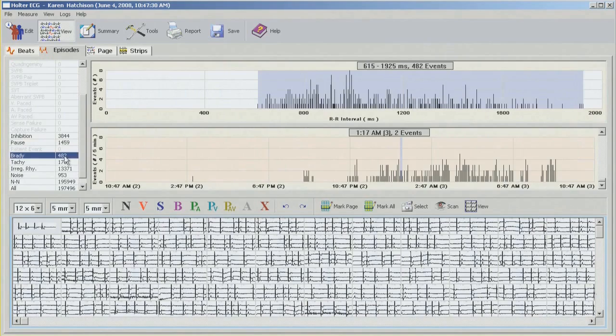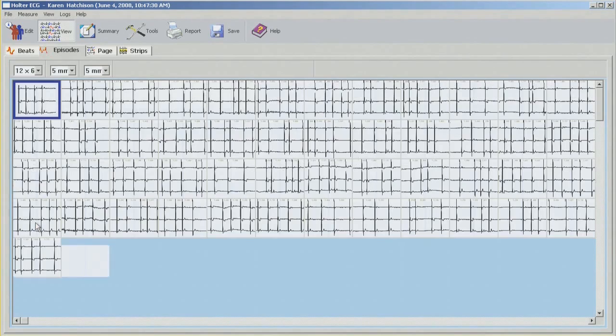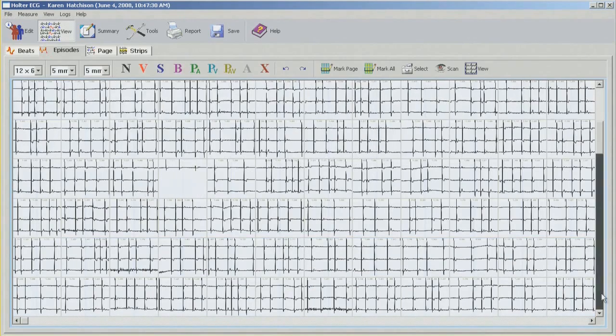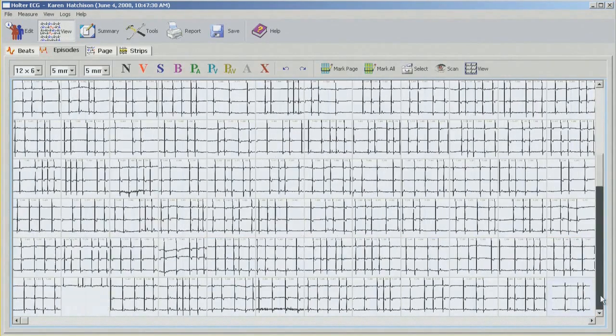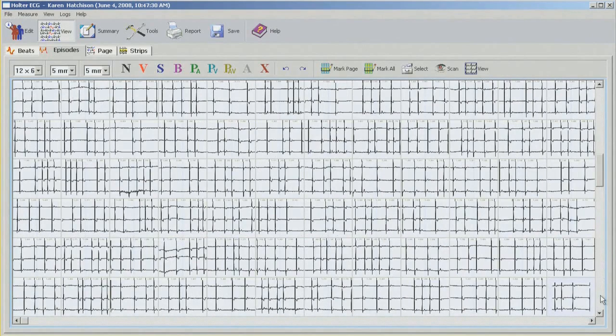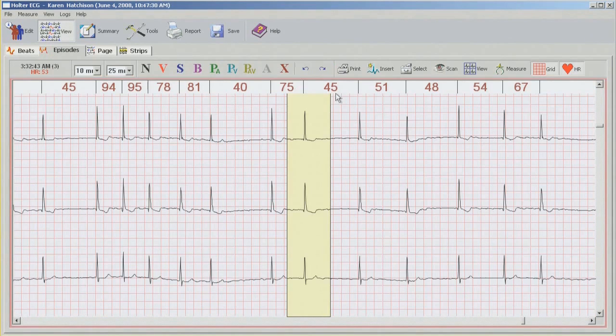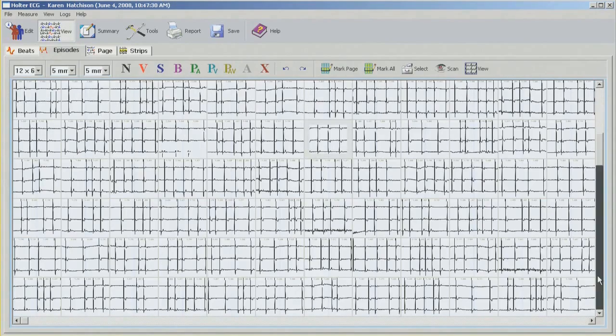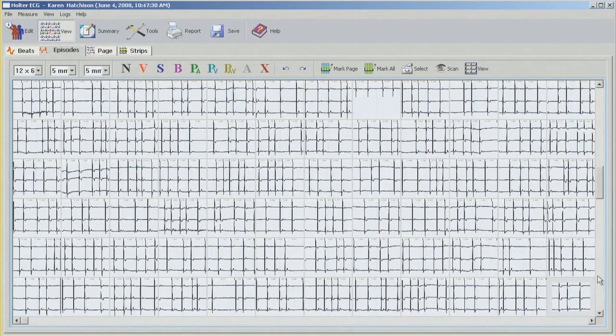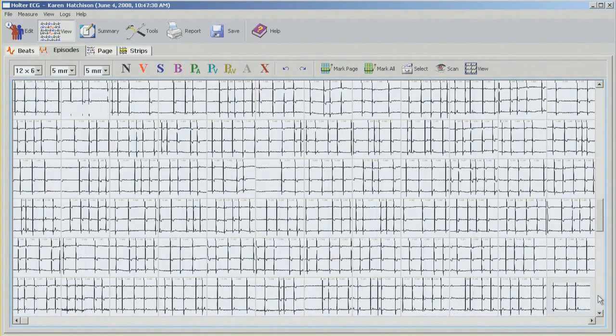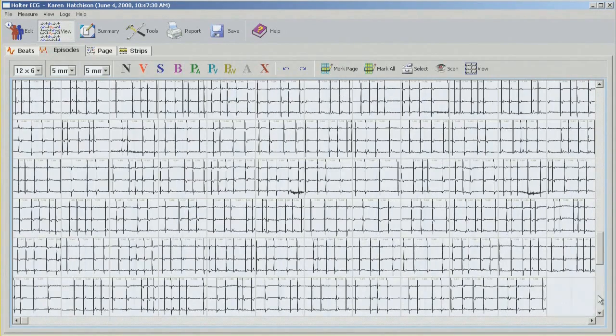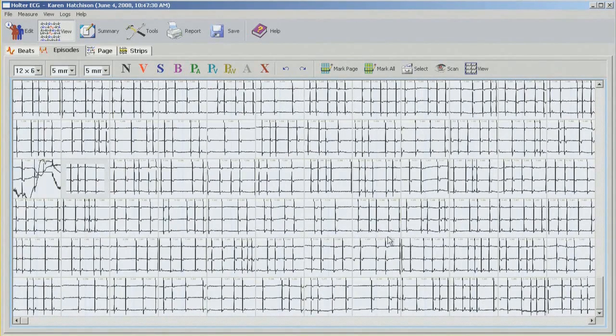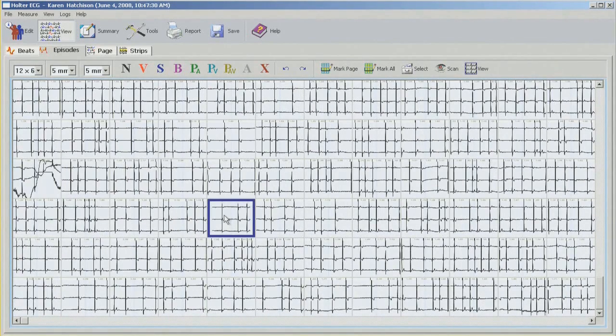Moving on to Bradycardia events. Again, just quickly going through to make sure there's nothing missing. If I want to look at something, full disclosure. Again, just double click on any of the squares that you want to check. And this just seems to be slow AFib.